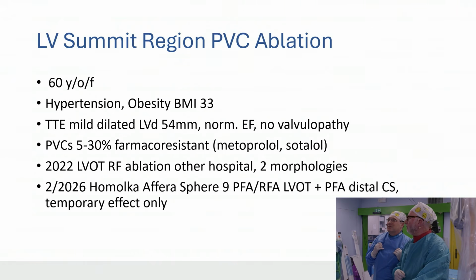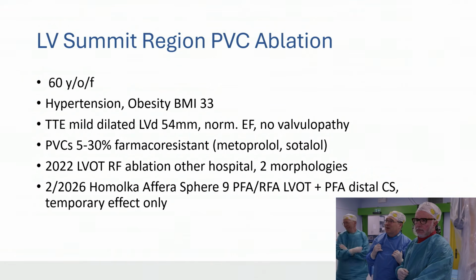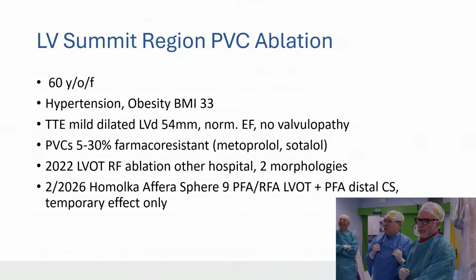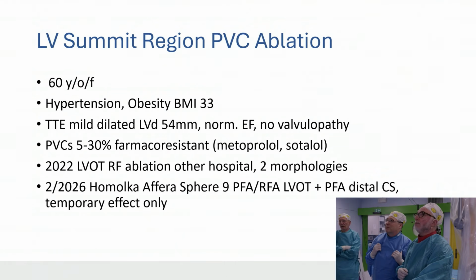But just to remind you, 4 years ago at another hospital there was an attempt from the LVOT with 2 morphologies which failed, and we tried Afera in February as well. But it was only a temporary effect, minutes, up to 1 hour, and then it came back. So now, just after 3 months, she is coming again for this. So please, next slide.